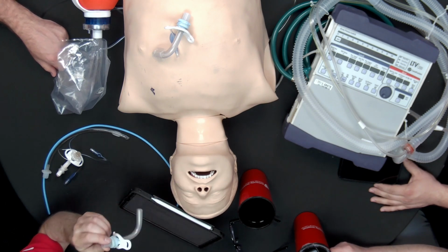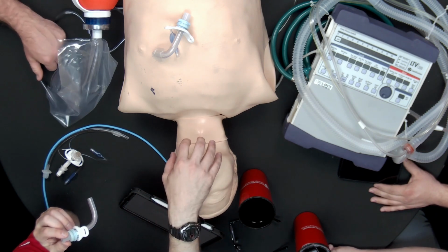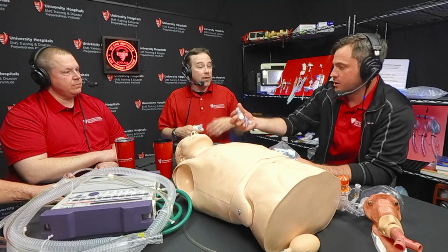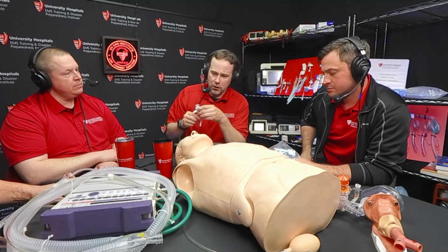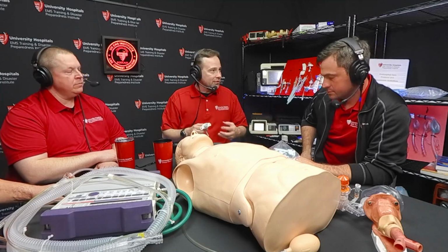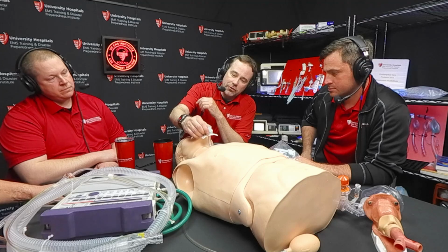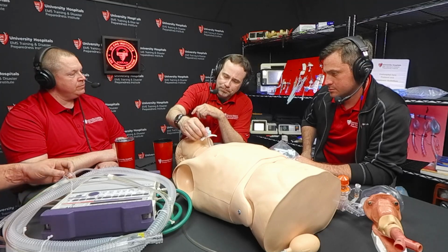These patients may be walkie-talkie, depending on level of insult and what air they can get through their glottic opening. They may or may not be able to move enough air to make some sounds, or they may have a sound block. They might have a speaking valve on there, which allows some air to get up through the glottic opening, where it may be insufficient for them to breathe daily. They can get enough past to verbalize some stuff and make their needs and wants known, and communicate effectively with other people.